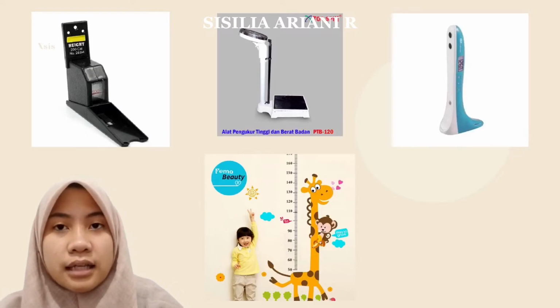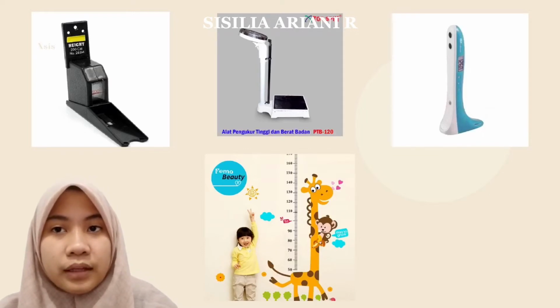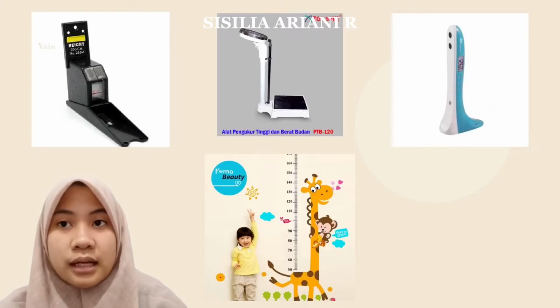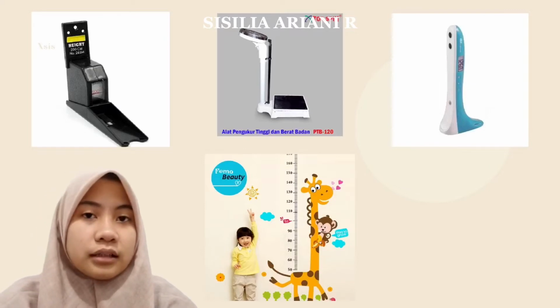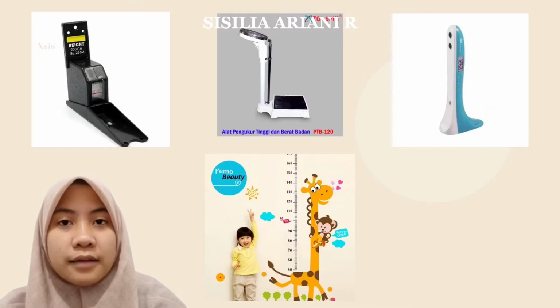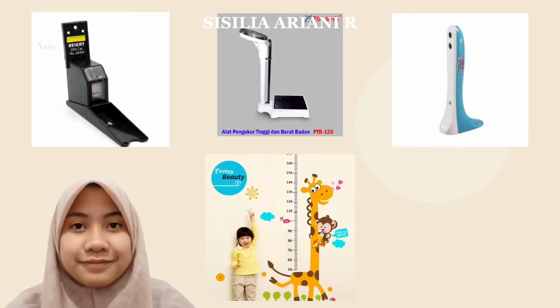The second picture is a height measuring instrument that includes both height and weight. The third is digital height measuring tools, with technology used to measure in various ways, and some use infrared and ultrasonic. The last picture is sticker height measuring tools. This measuring tool is only used for children.